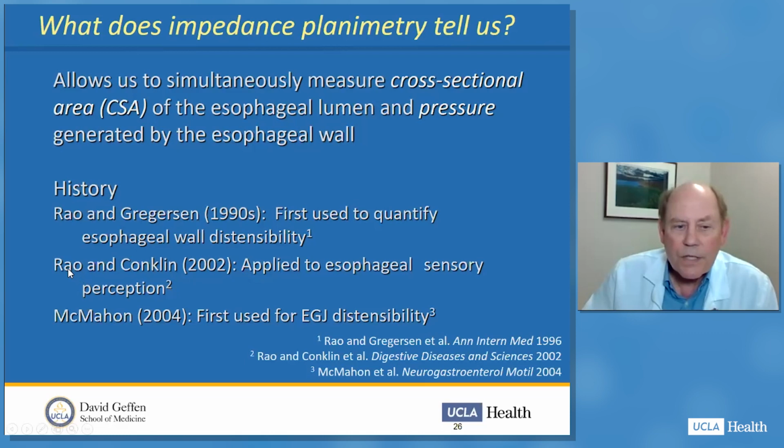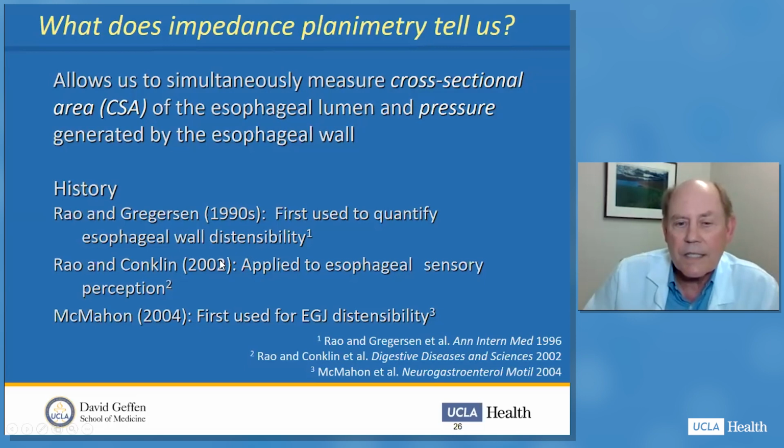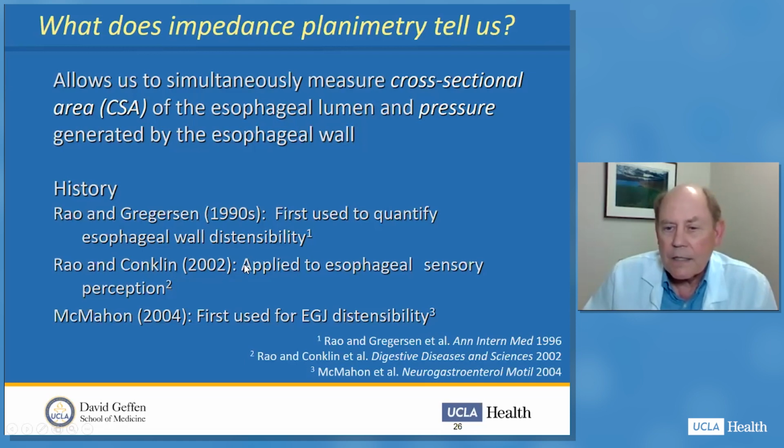I got in the act with Satish in the early 2000s, just before the time I left the University of Iowa. And we used the impedance planimetry to help us better understand sensation and sensory perception in the esophagus. And then McMahon in 2004 was the first to use the device for esophagogastric junction distensibility, and it's one of the major uses even today.